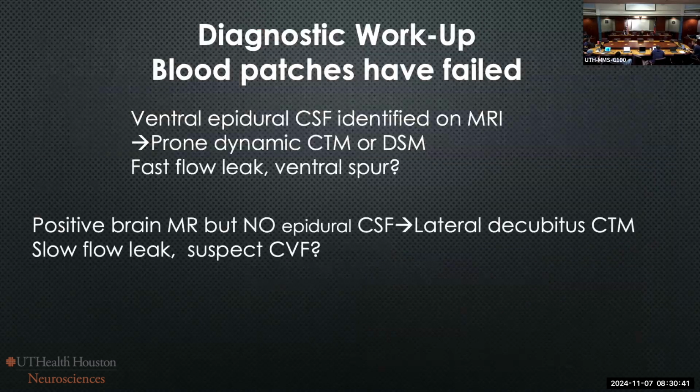So let's talk about diagnostic workup and when blood patches have failed. If we see that there's epidural CSF ventrally on the MRI, we do a prone dynamic CT myelogram or a digital subtraction myelogram.